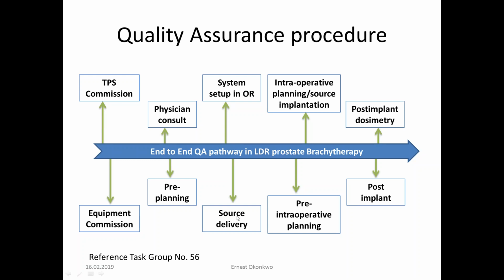Then for source delivery, you want to make sure that the radioactive sources are being delivered in time. You want to make sure that they are not contaminated. And you want to make sure that the right source and the right activity is being delivered.